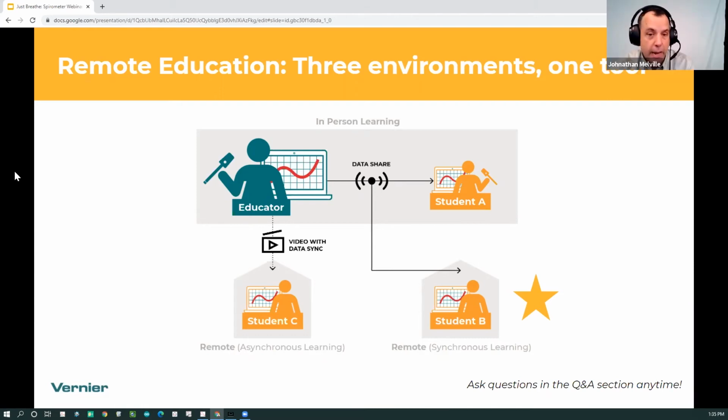It's effectively the same. You just don't select that adjusted volume channel. There's no channels to select, but everything else is the same. You just plug it into the interface. So you would plug it into your LabQuest Mini interface, plug that into your computer. If you just launch it, it's going to be all set up. And then you would just do everything the same.